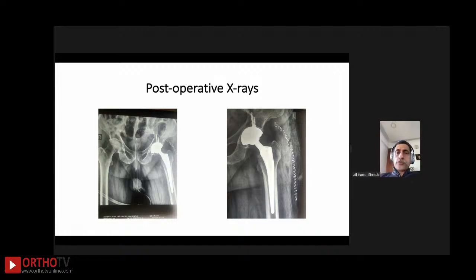No, if I have to do a THR, for some reason that I have to replace the acetabulum and I don't want to do a bipolar, then obviously in a smaller cup it is difficult because you have to have a much smaller head. You may end up putting a 28 head. And if you are not comfortable, then I will go for a dual mobility.